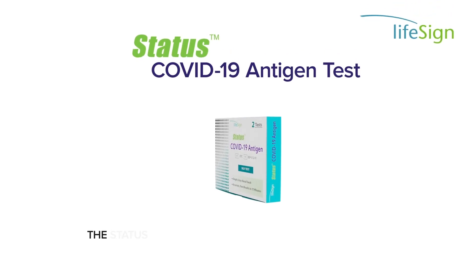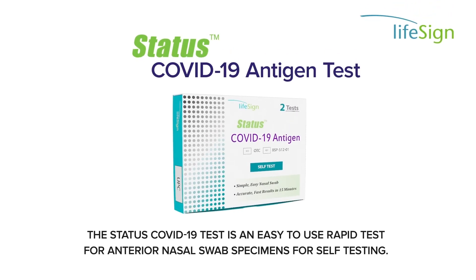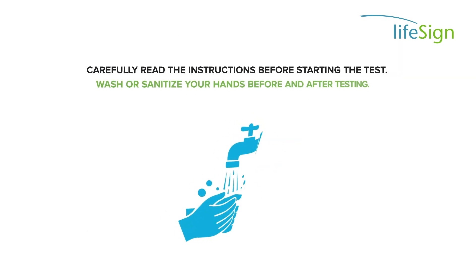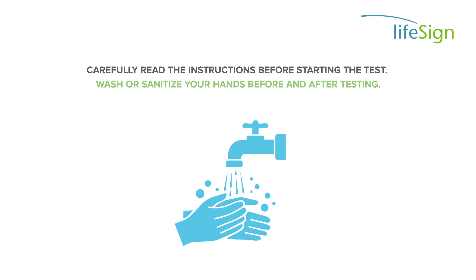The Status COVID-19 Test is an easy-to-use rapid test for anterior nasal swab specimens for self-testing. Carefully read the instructions before starting the test. Wash or sanitize your hands before and after testing.